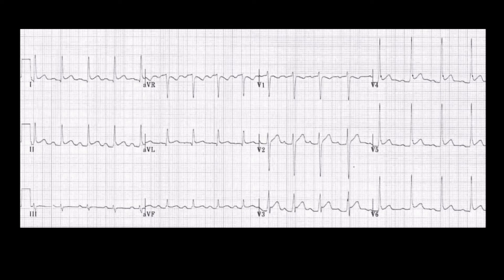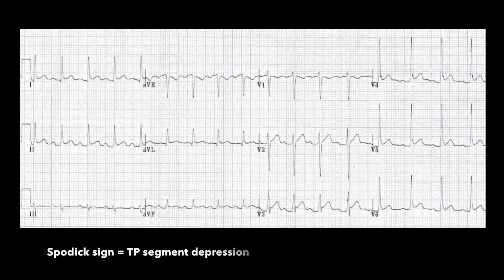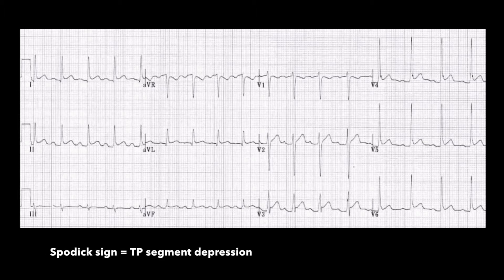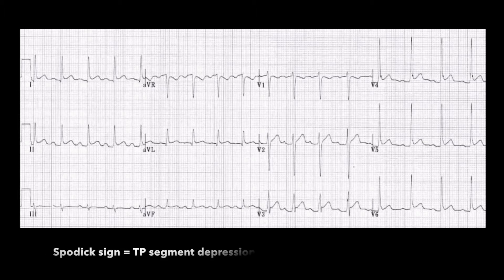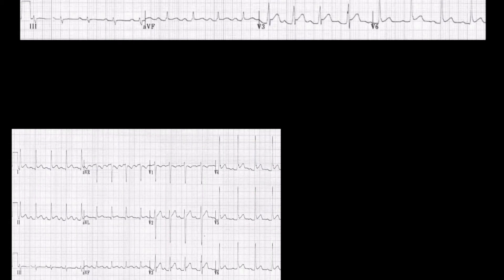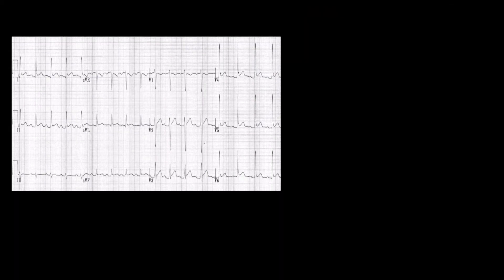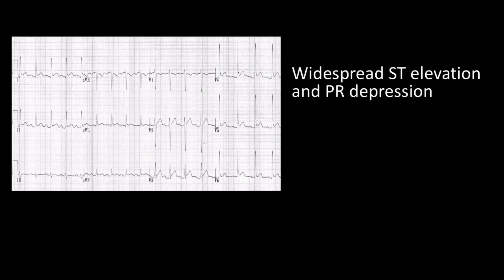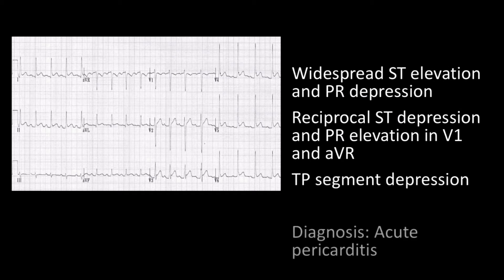You can also see what we call as the Spodick's sign, which is a TP segment depression. Considering all this with the history as well as the ECG, the diagnosis of this patient is acute pericarditis.